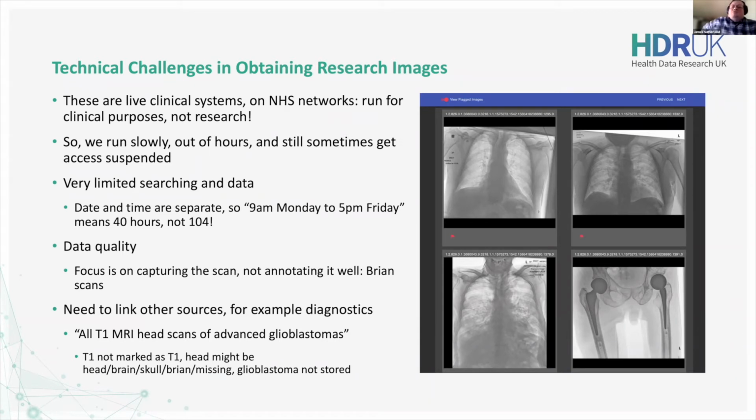So usually we run these requests overnight during quieter times for the system. And if there are any problems at all, we can have access cut off. This has happened a few times with our regional PACS feed for various reasons. Anytime there's a possible technical issue with the PACS, performance problem, or signs of data loss with another PACS user, one of their first fault finding steps is to switch off our connection and see if that helps. Because to them, research usage is almost expendable. Their priority is to maintain clinical service at all times, understandably.